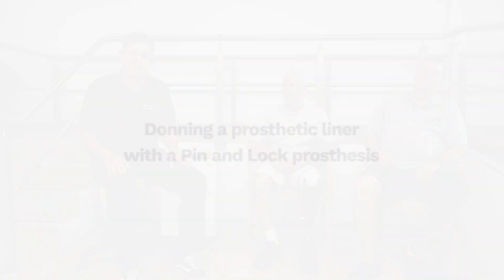Hi there, my name's Dakota. I'm a certified prosthetist with Spayer AutoBot Care. Today I'm joined here with Guy and Bill, and they're going to be helping us demonstrate the correct way to put on a prosthetic liner and a prosthetic sleeve.